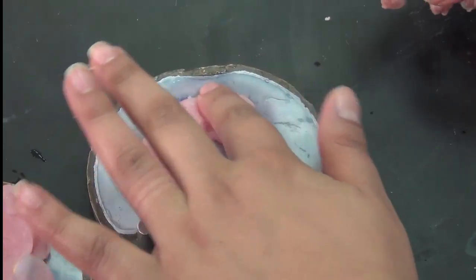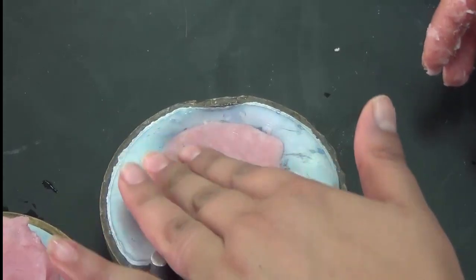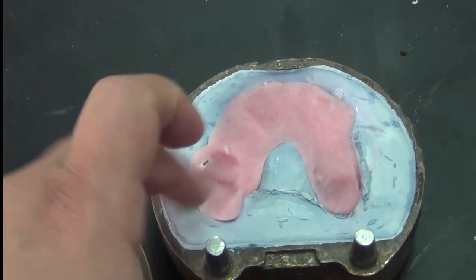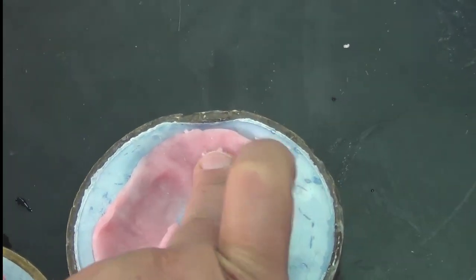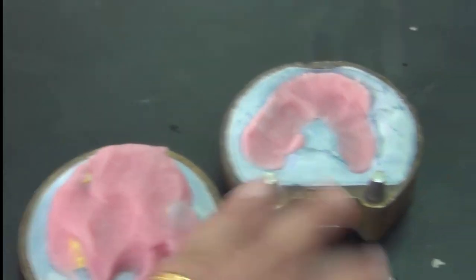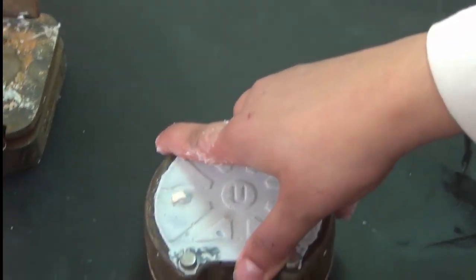This will increase the flow of the material into the interdental papilla. Remember that we have located the wax in a way we have interdental papilla. So to make sure that the acrylic goes in between the teeth, we further press on this side, and then we reverse everything, put the flask back together, and we call this the packing step.